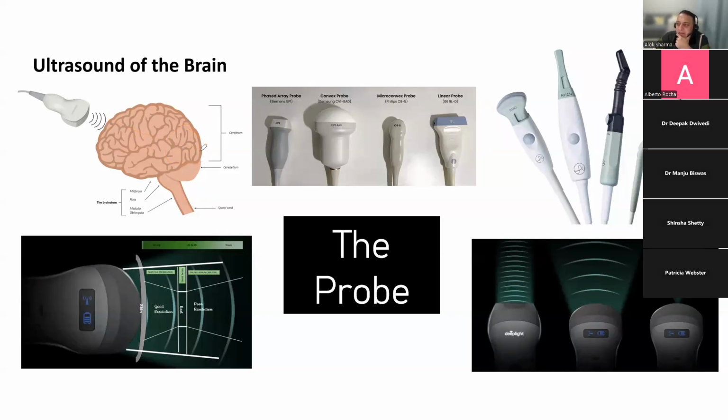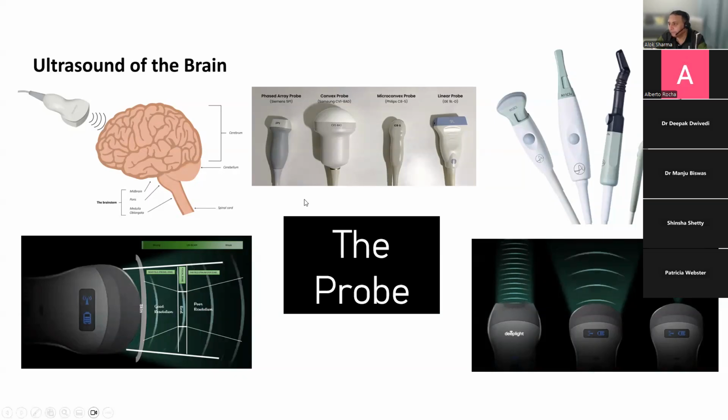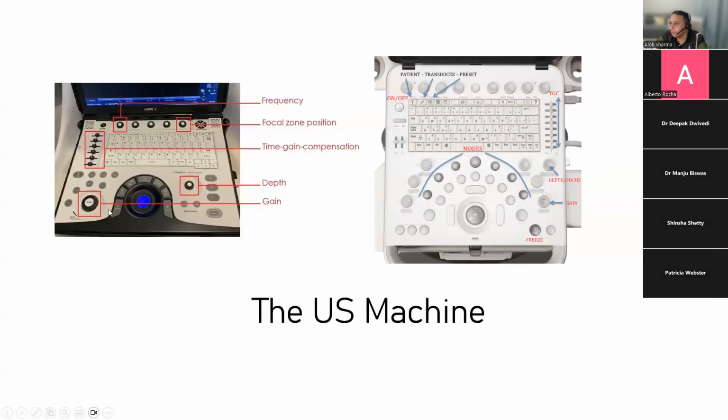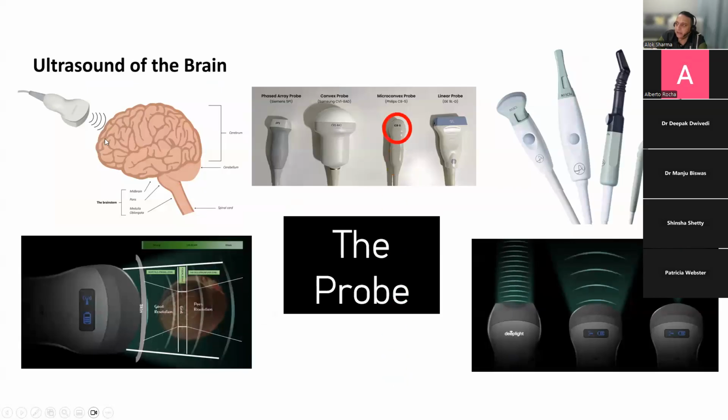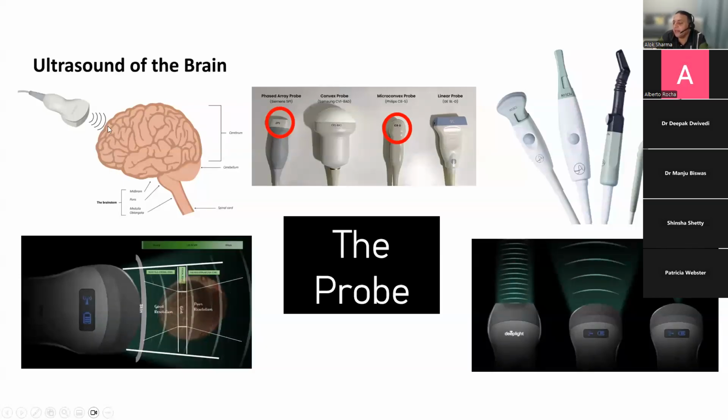So for that reason, we might have an image where we can see the superficial areas with adequate brightness, but we can't see the distal areas with adequate brightness. Now, potentially, we can then go back to using the gain button. But if you turn the gain up as a whole, you are going to turn the brightness of this area up even more, and this will appear brighter, and the back may appear bright to a point where it gives you good resolution, but this area looks too bright. And that is why we need time gain compensation.